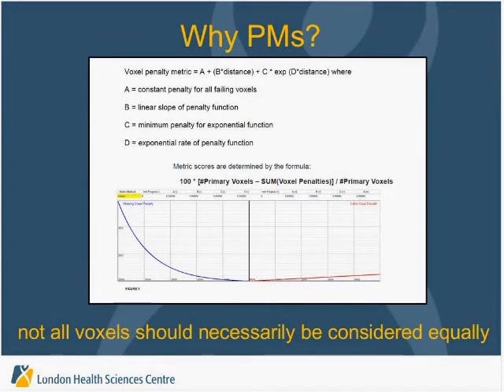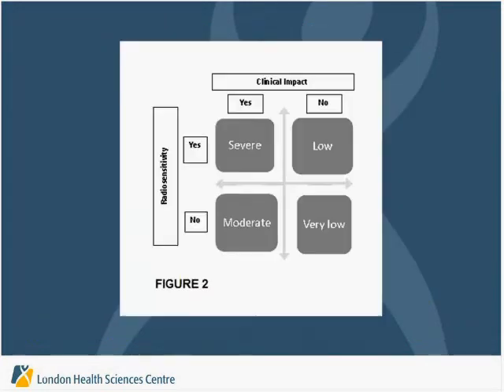So that's why we like the structure program. It allowed us to actually do differential penalty metrics depending on what we define a priori as important differences. Here, as an example, you can see a metric where, if it's under-contoured, there is sort of a quadratic or exponential contour penalty on the one end, whereas if it's over-contoured on this side, it was more linear and more gradual. It's just an example of one potential penalty metric that can be created.